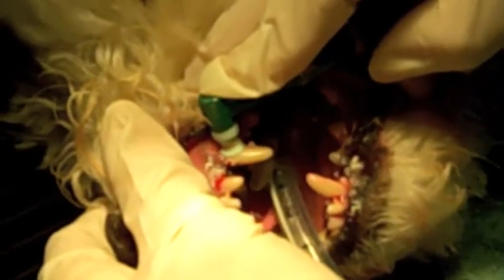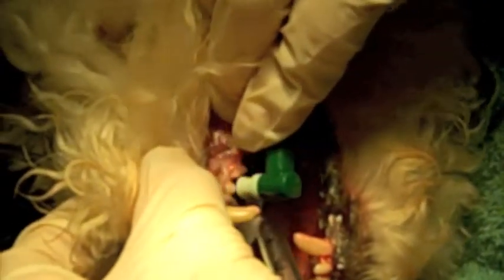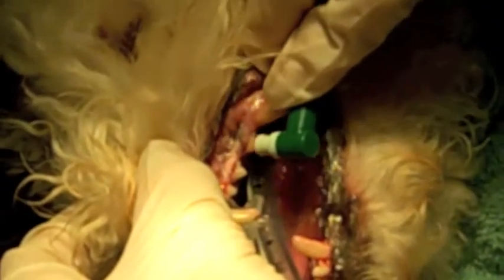Test it, make sure it works. And we're going to make sure we get the surface. You don't have to be on there a long time, and just slightly under the gum line. This just helps smooth out the surface, if there was anything on the teeth, and also from the cleaning sometimes.